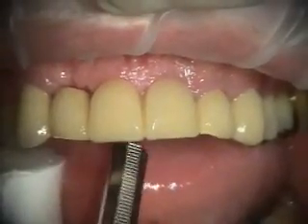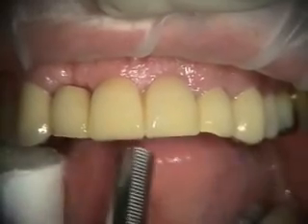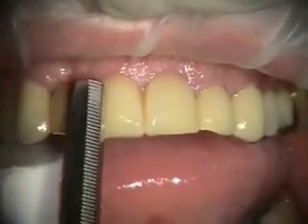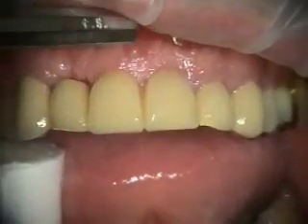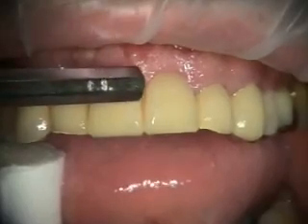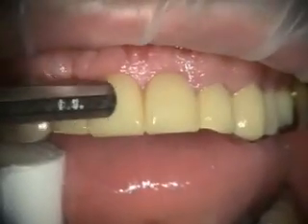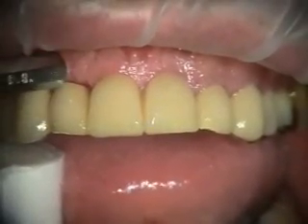When we look at the tomos, the nasopalatine canal is rather large — it's almost too large. You can see that his midline is shifted toward the right in relationship to the midline on the bridge. So we're going to be able to place an implant here but not one here.